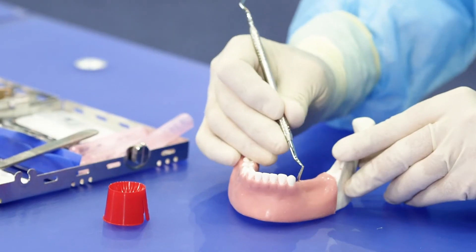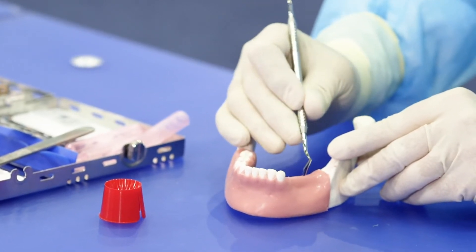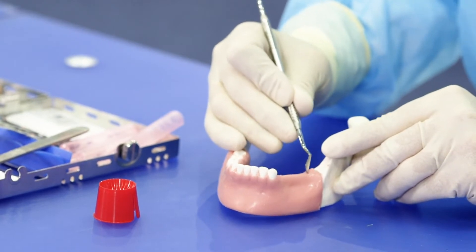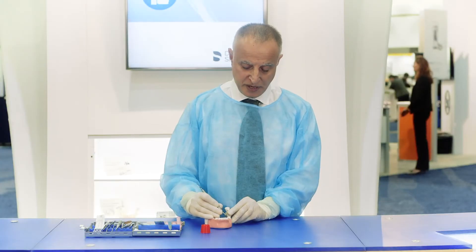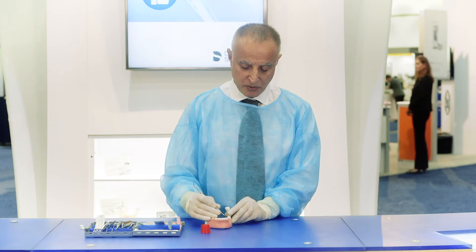I usually start the elevation of the flap with the Kirkland knife. It's a full thickness flap elevation both on the buccal and the lingual aspect of the ridge.